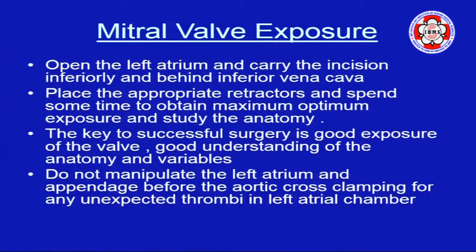The key to successful surgery in any area is a good exposure of the valve, good understanding of the anatomy, and the variables that come across, because not every patient is the same as another patient. Do not manipulate the left atrium and appendage before the aortic cross clamping, for any unexpected thrombi in the left atrial chamber.